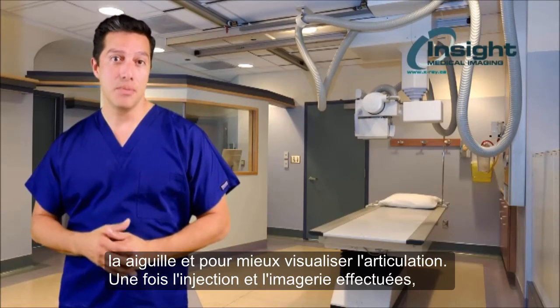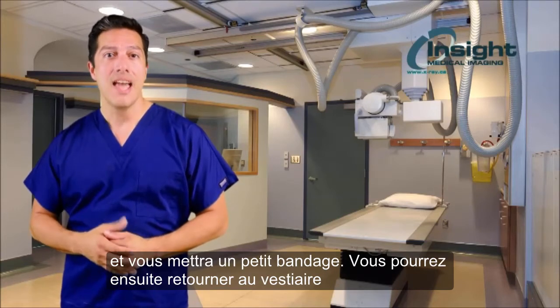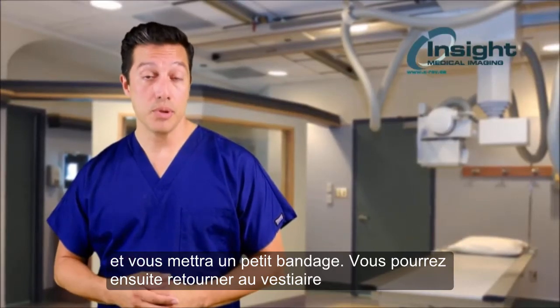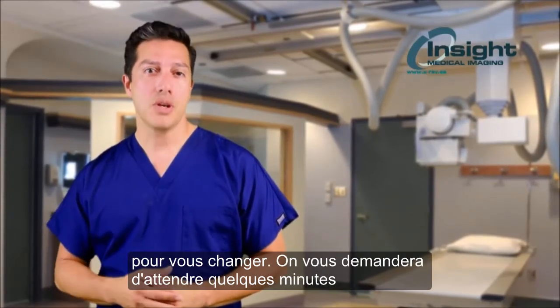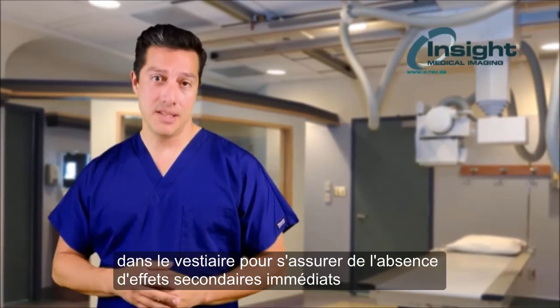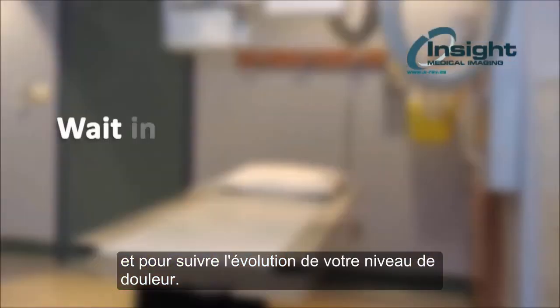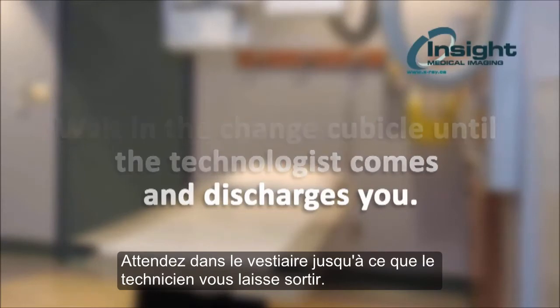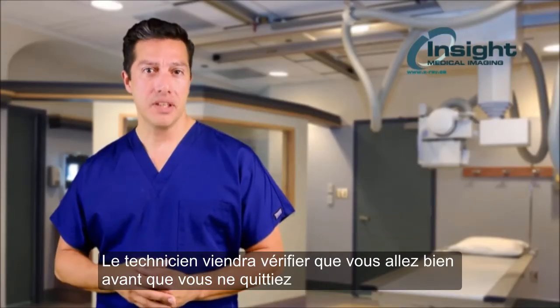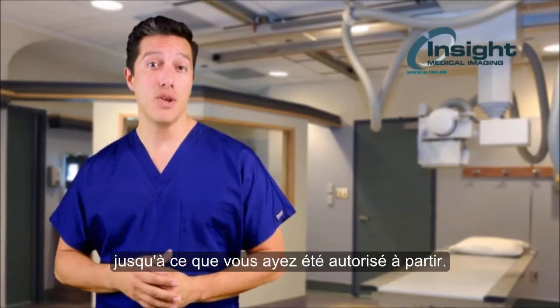After the injection and imaging are completed, the technologist will assist you in cleaning the prep solution from the injection site and will apply a small bandage. You can then return to your change cubicle and change back into your street clothes. You will be instructed to wait a few minutes in the cubicle to make sure there are no immediate side effects from the injection and to monitor changes in your pain level or pain score. The technologist will come and check you before you leave the clinic, so please be patient and wait until you've been given the okay to leave.